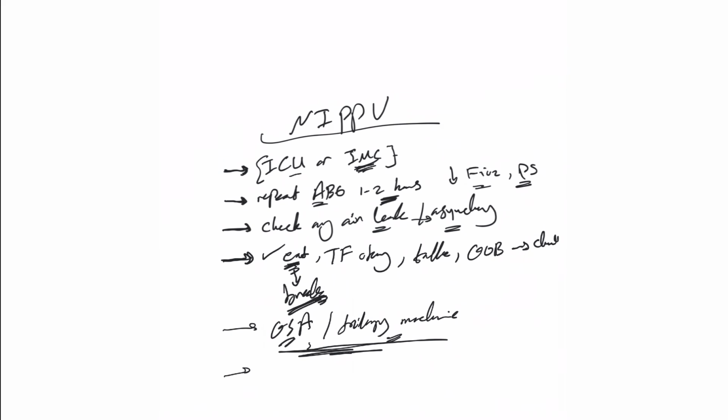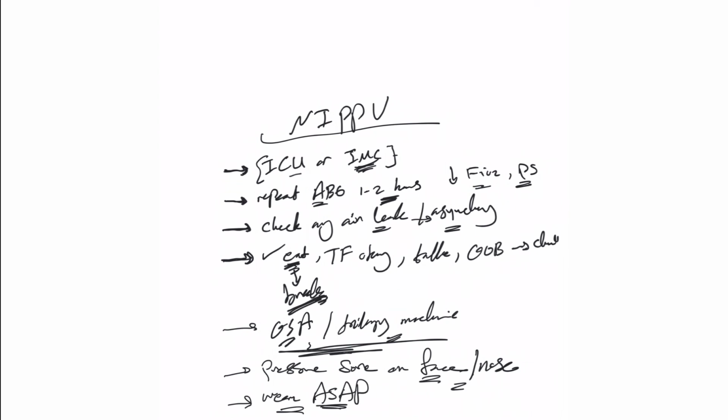Examine them for any signs of pressure sores on their face or nose from the mask they have. This happens especially with prolonged use of these non-invasive ventilations. So these are the main things, and of course, wean as soon as possible, and we'll talk about weaning in the next episode.